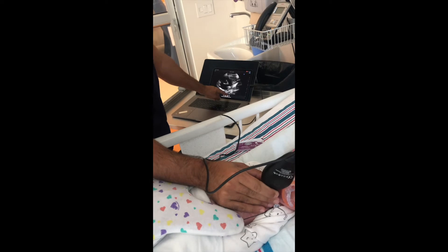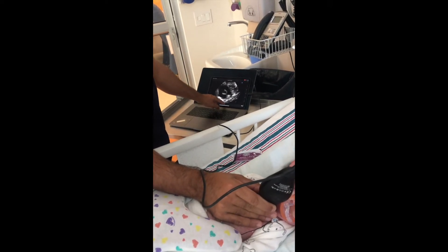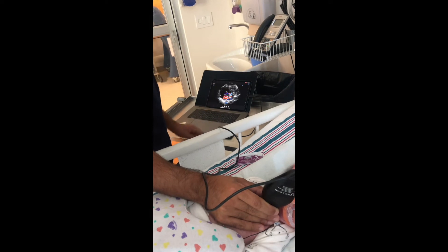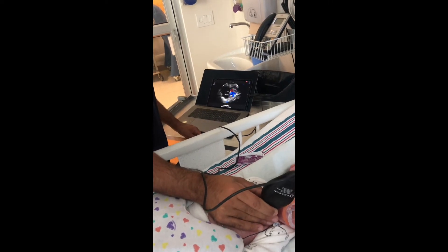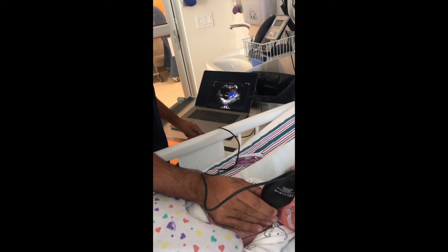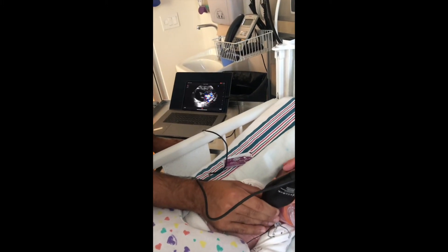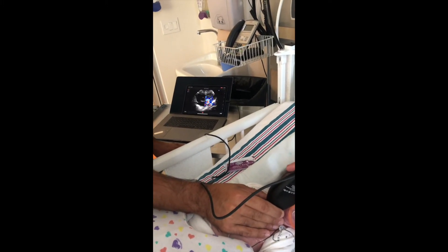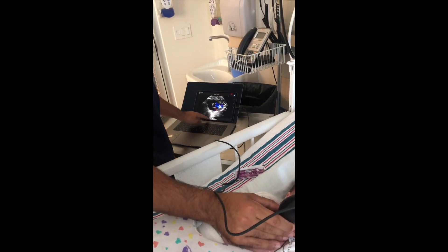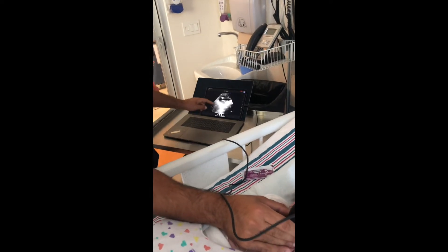From the parasternal short axis view, you can slide towards the left shoulder, just under the clavicle area, and obtain the PDA view. In the PDA view, you can use the color presets — either pediatric cardiac or pediatric abdominal — in order to appreciate the flow through a potential ductus arteriosus that may be patent in some newborns. The ultrasound probe may allow you to assess by color the presence as well as the directionality of the ductus if it is present.